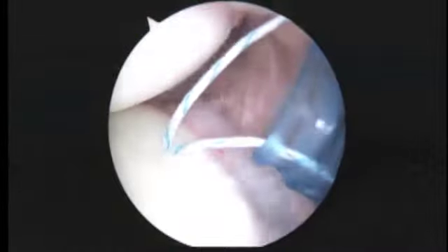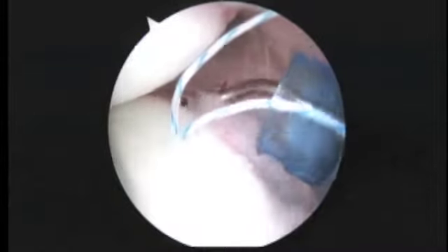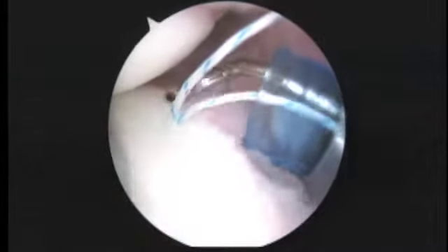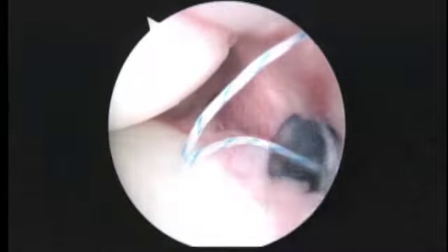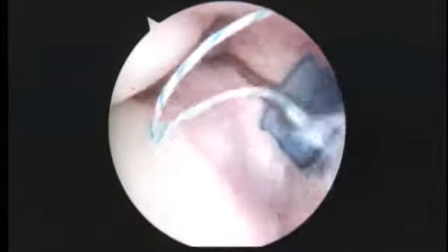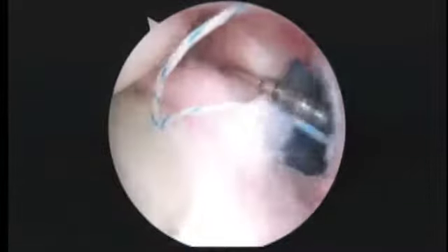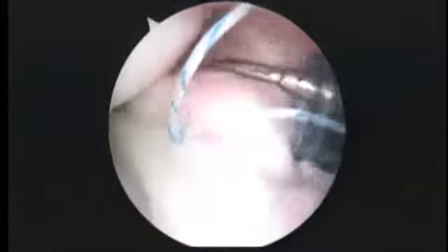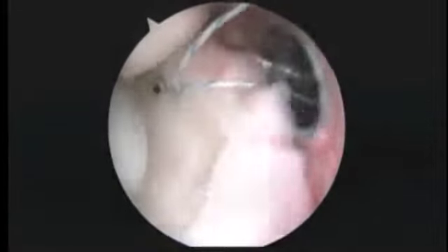And we're going to look in with our turn to the left hook and the grasper in the front. This hook that you see is loaded with a black wire called the super shuttle. You can see it right there. And now with our hook, we're going to go ahead and start here, rotate back. Pass.